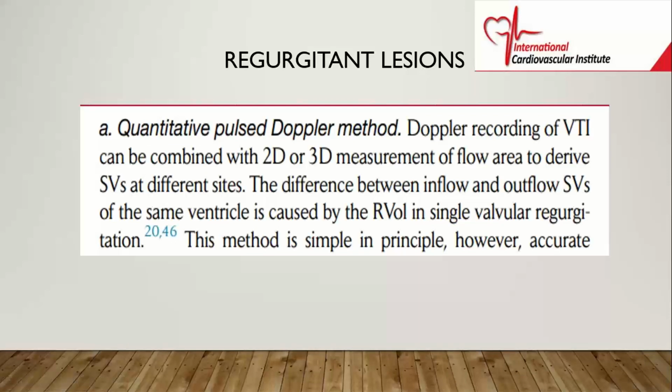So we remember the stroke. We can look at stroke volume, and we have echo techniques, especially Doppler, to look at the forward flow across the mitral valve. So if we have mitral regurgitation, in systole, blood is going to flow from the LV across the mitral valve into the left atrium, and then in diastole, we're going to get forward flow across the mitral valve, but that forward flow is going to be the regular flow plus the regurgitant volume.